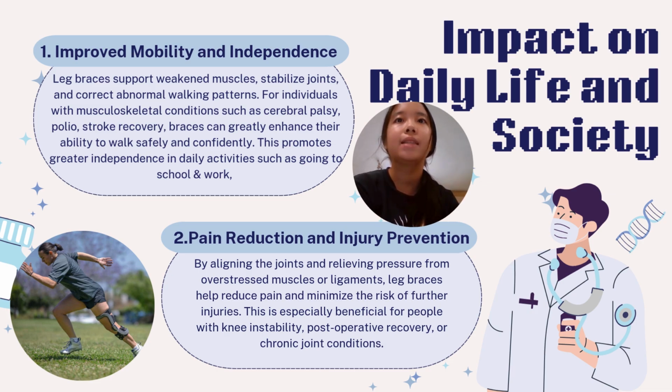This promotes greater independence in daily activities such as going to school and work, and students don't need to depend on their parents to fetch them, or working adults can function on their own. The second one is pain reduction and injury prevention. By aligning the joints and relieving pressure from overstressed muscles or ligaments, leg braces help to reduce pain and minimize the risk of further injuries.